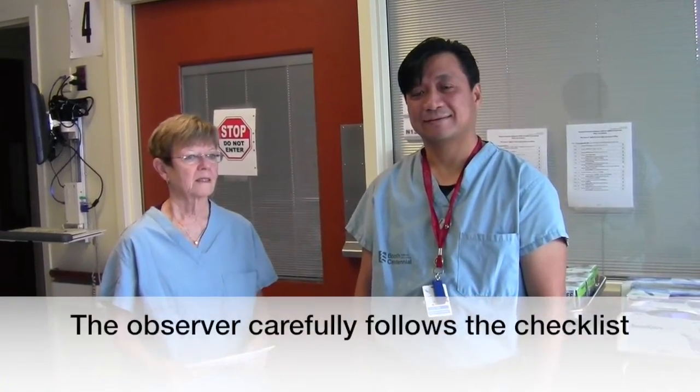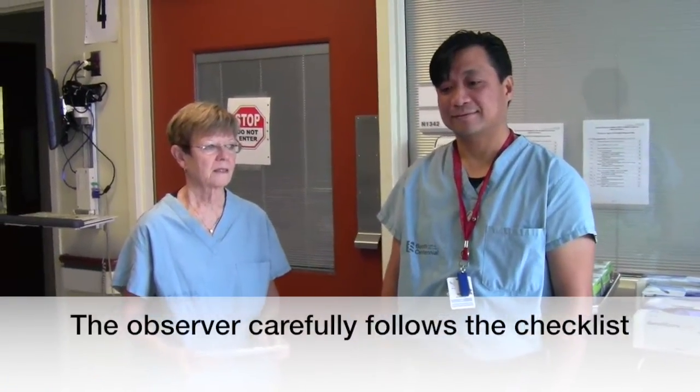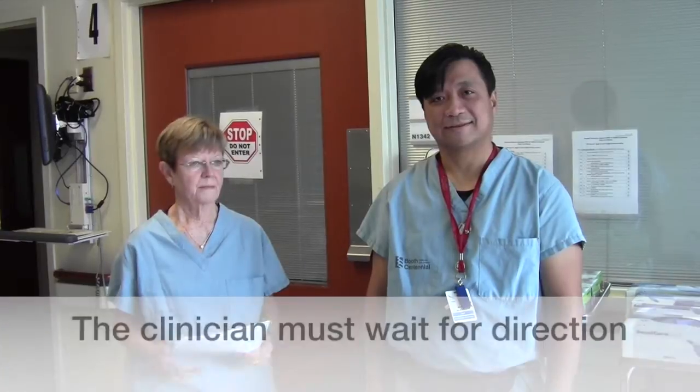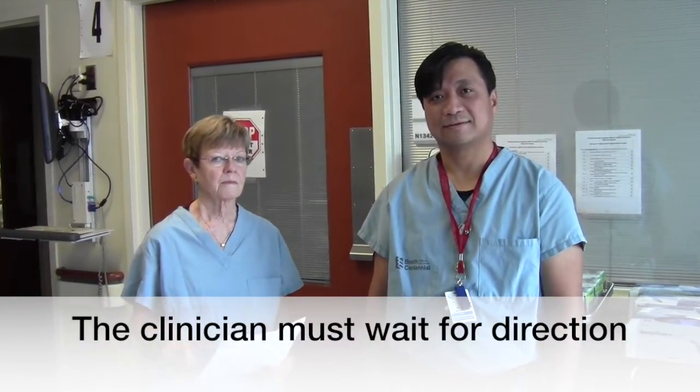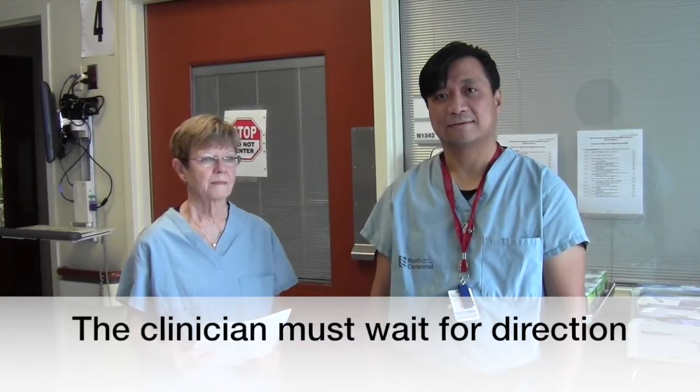You will notice Linda, as observer, will carefully follow the checklist. Donning and doffing is a two-person procedure: the clinician who is donning and another who will be observing and assisting. The observer's sole responsibility is to ensure that PPE is being donned accurately and to monitor the clinician doffing the PPE for potential contamination. You will also notice Brian is waiting for direction for both donning the PPE and, more importantly, taking it off. It's important to wait for direction because the observer needs to ascertain no steps are missed and no contamination occurs, especially during the doffing process.